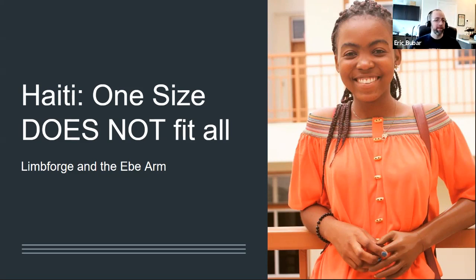So cosmesis opened up a new area in trying to make our devices not just cartoony, but also realistic looking, like this, the most recent design. So this is all cartoony colored, but it looks much more realistic than some of the earlier Enable designs. You have the same kind of look as a hand. It's very trim, it's not super bulky. So it kind of melts away into the user that's actually using it. It doesn't stand out so much. So that's good for some countries or some individuals that don't want to stand out.